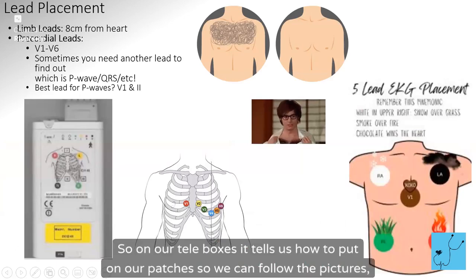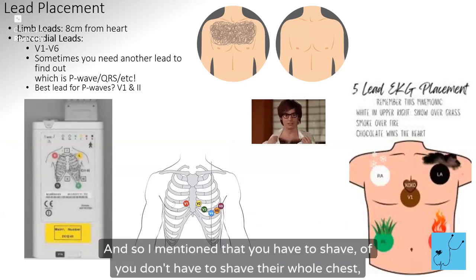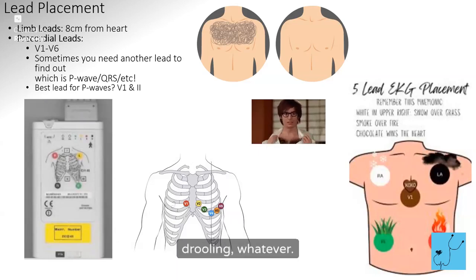On our tele boxes, it tells us how to put on our patches so we can follow the pictures, the diagram. This is just an illustration of where the 12 lead chest leads go. When you're looking at a 12 lead, the V leads are all chest leads, anterior leads. I mentioned that you have to shave, though of course you don't have to shave their whole chest, just the spots where the patches are going to go. And we're supposed to change them every 24 hours. That can affect accuracy, especially if someone is sweaty or drooly or whatever.